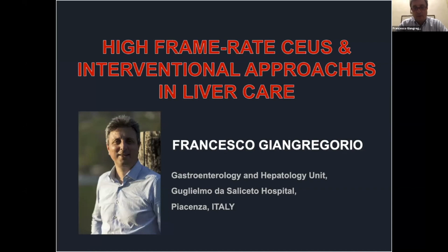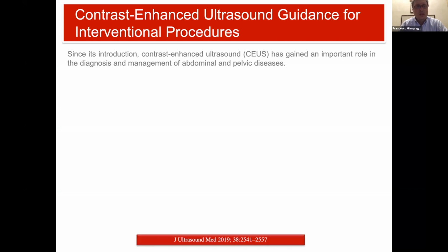Thank you for your attention. My topic is about high frame rate contrast enhanced US and the new technologies in interventional approaches in liver care. As said, since its introduction, contrast enhanced US has gained an important role in the diagnosis and in the management of abdominal and pelvic diseases.